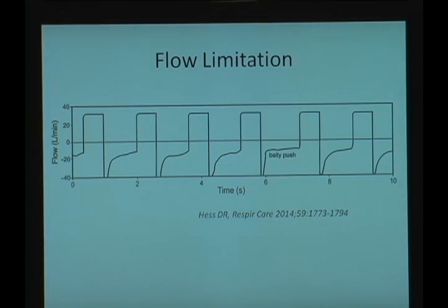So this was originally a screenshot off of the ventilator, but I had somebody redraw it, which they did a really nice job redrawing so I could publish it in a paper. But here is a patient up in the MICU with severe COPD, and on the fifth breath, the pulmonary fellow pushes on the belly. And he really pushed harder than I probably would have pushed.